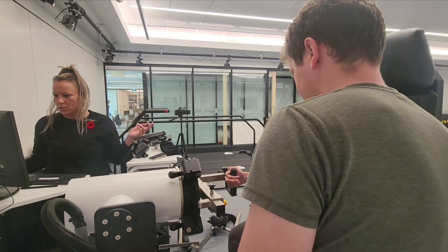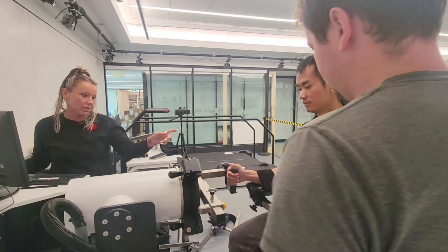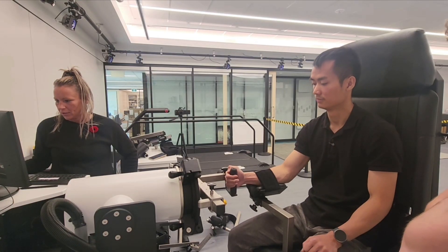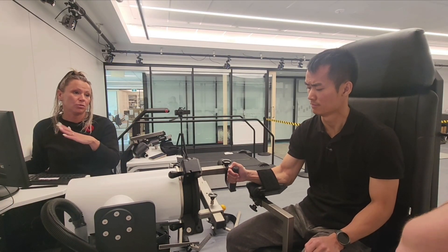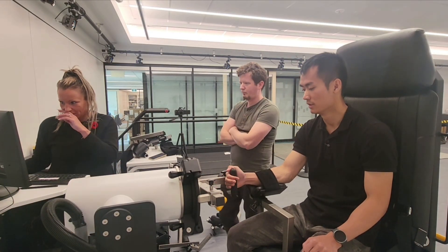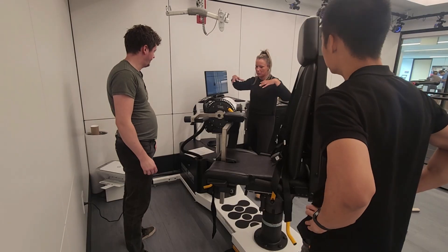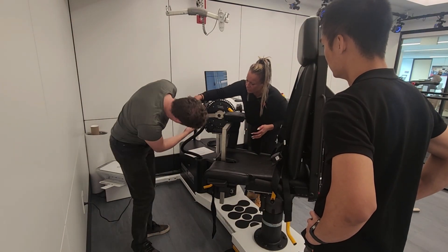When he says that, you just hit clear again. We're leaving a little bit extra so it counts our reps, because now we know how hard it was. Tracking — go one way, the other. You could give them numbers — you say I only want this person to move from this to this. So these are going to show 113 was our position of our angle, so that's 113 degrees.